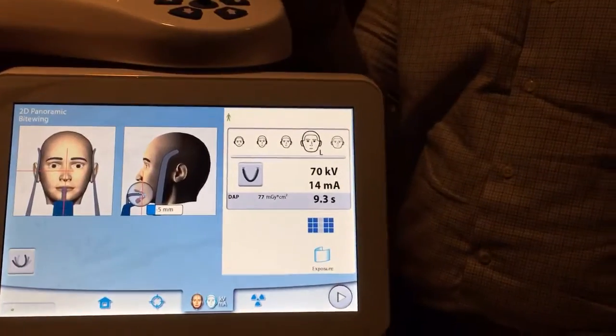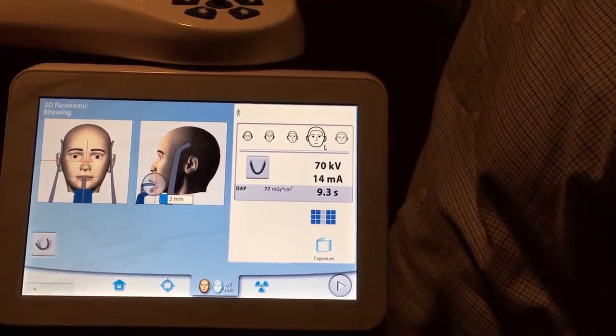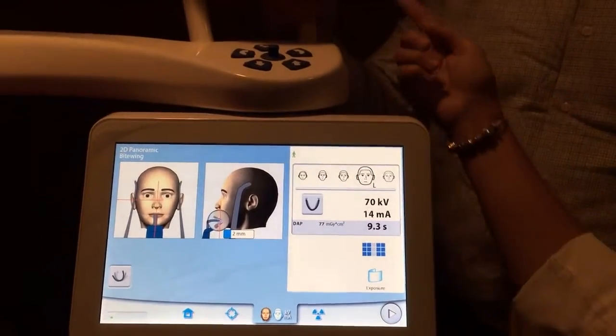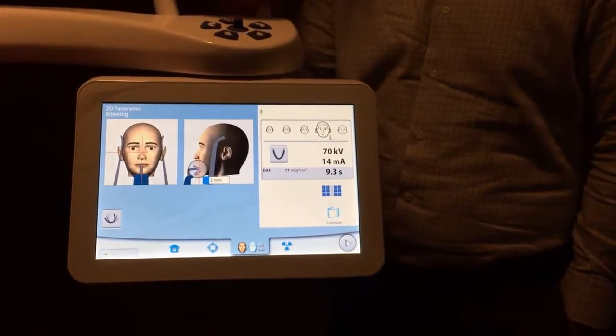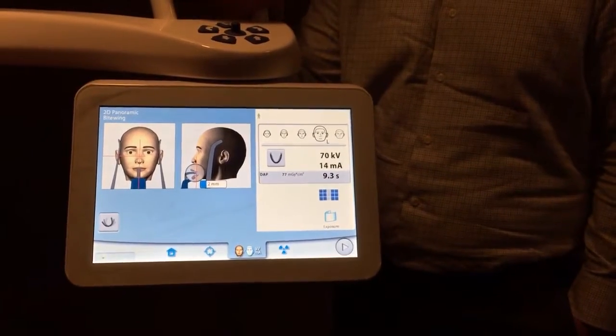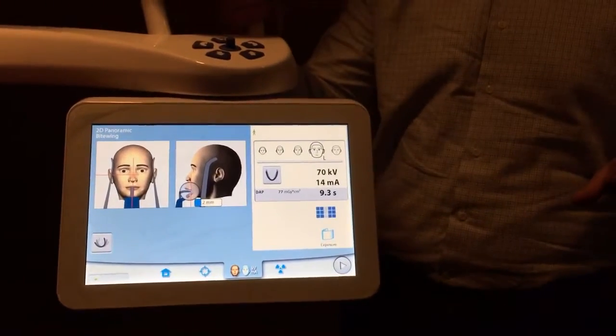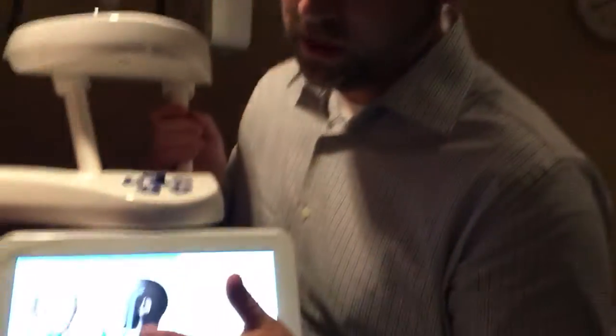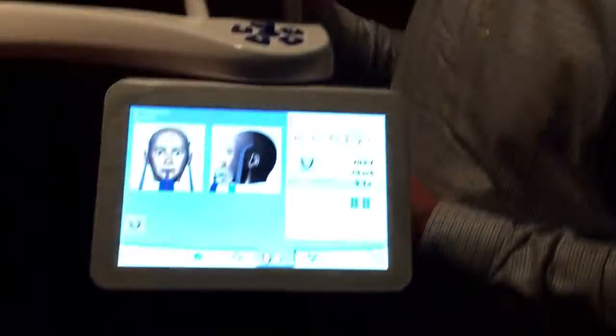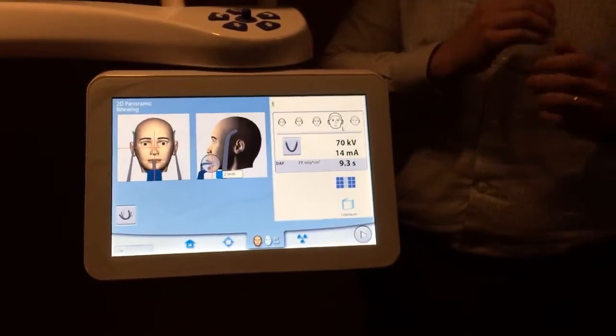Move it — look at that number change. I was doing it on the pan and not on bite wings — that was my mistake. This laser was previously only used for 3D; now we use it for bite wings too. Easy way to remember: when taking bite wings on an adult, what size film do you grab? It should say two on the screen. You can do this on little kids too — select extra small patient, and for small, medium, large, and extra large you'd grab a size 2 film.